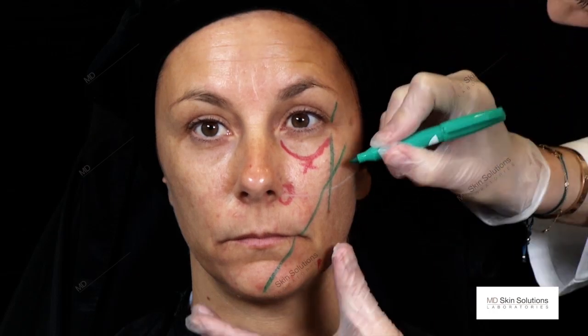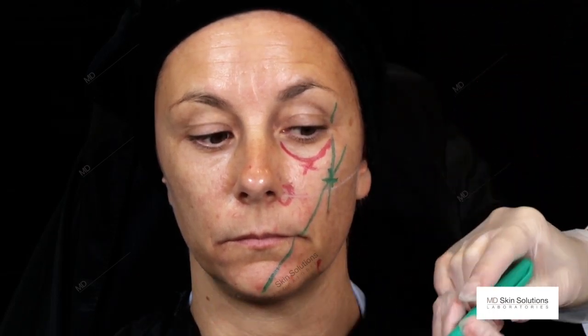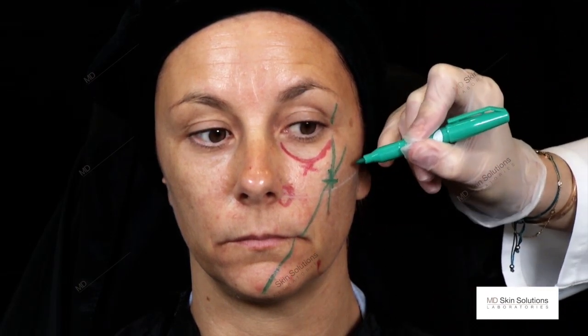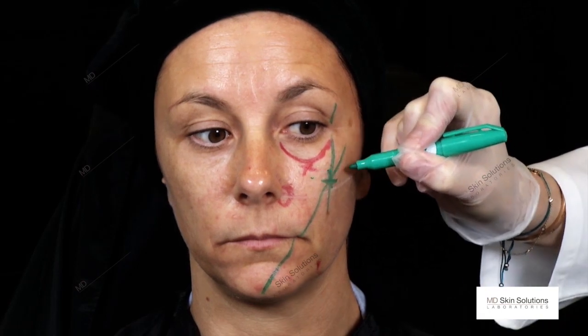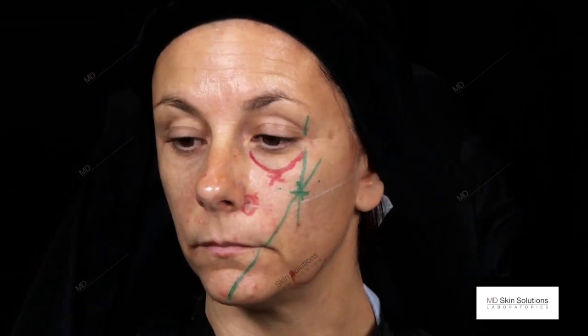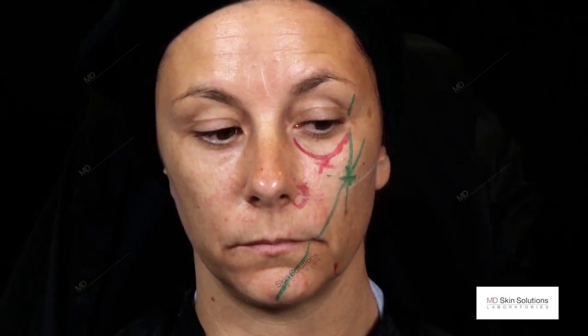This is the entry point where I start the injection. The second and possibly third injection will be medial and lateral to this in a banana-wise shape. So these are the lines we do at least theoretically draw on a patient's face to plan our injection strategy.